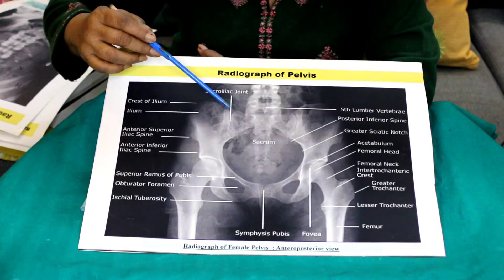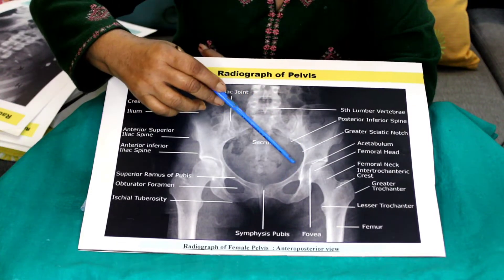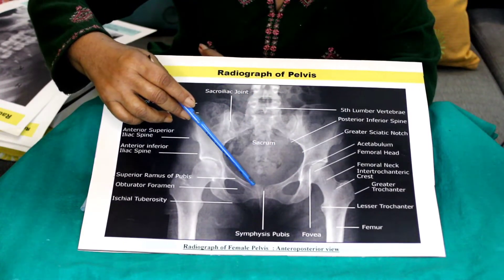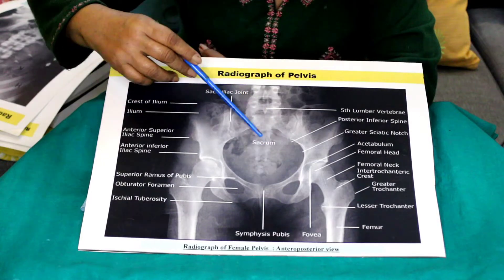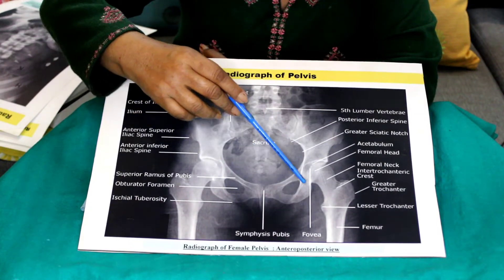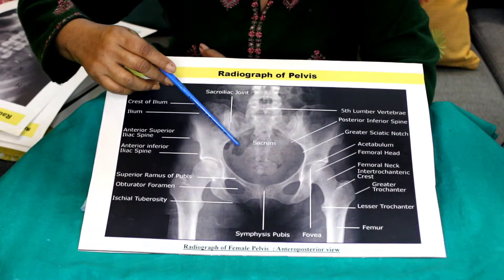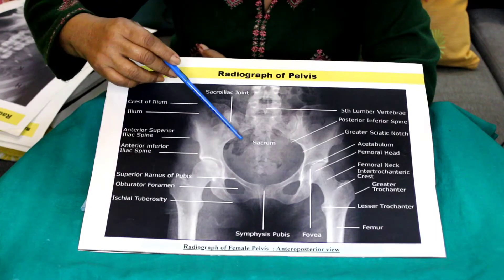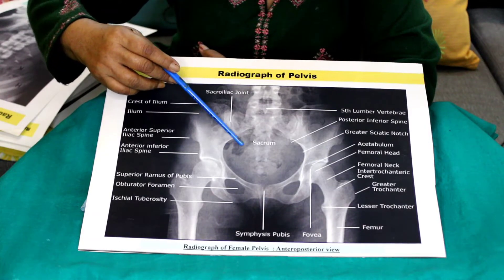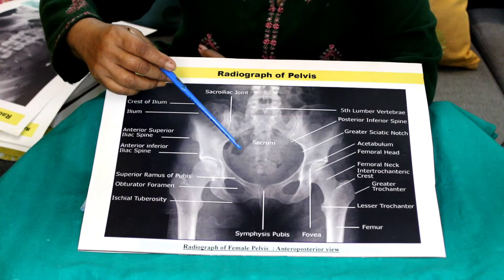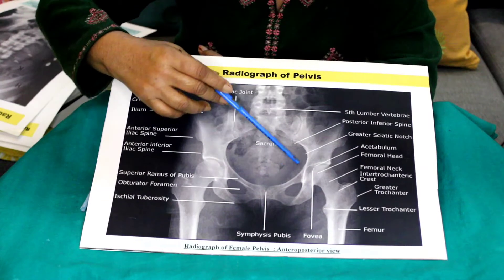Now you will see here the hip bone — there is the medial arcuate line of the hip bone, the superior border of the pubis, and the superior ramus of the pubis. This is the obturator foramen, and this is the ischial tuberosity. You will notice the black color here is the shadow of gas. When an X-ray of the abdomen is done, you have to remove the gas by giving a laxative the previous day, and after 12 hours of fasting you will do the X-ray.